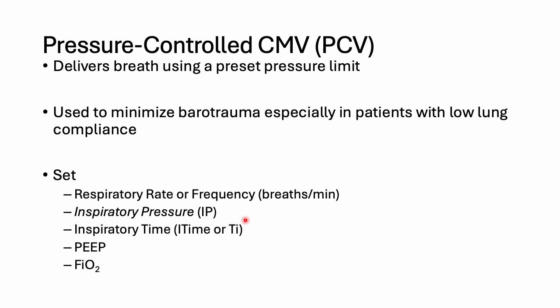So notice in this mode, volume is not a set parameter, because in this mode, the volume becomes a variable depending on the person's lung characteristics. Then these two components, the PEEP and the FiO2, determine the oxygenation. It helps with the oxygenation that we talked about earlier.